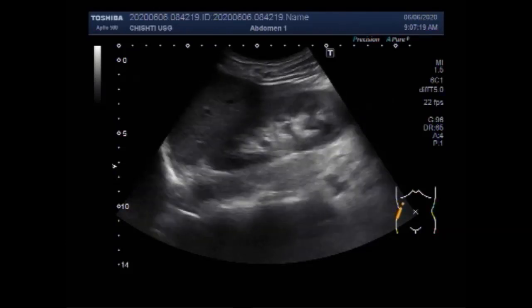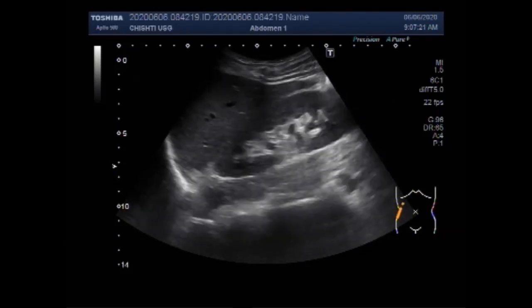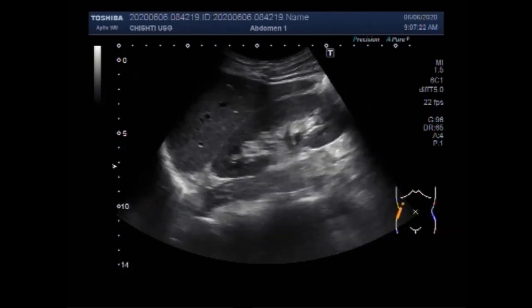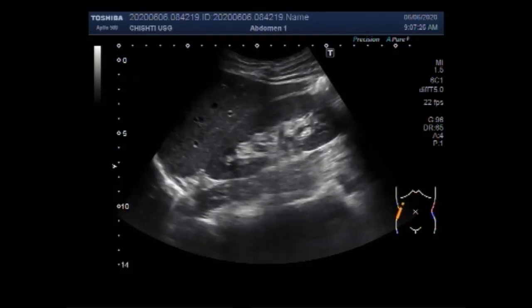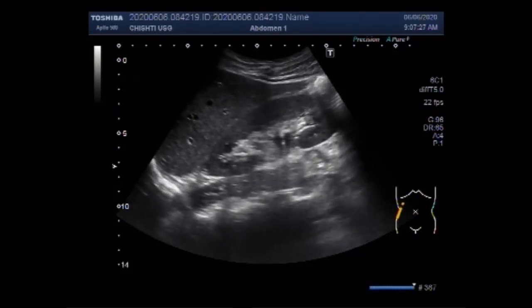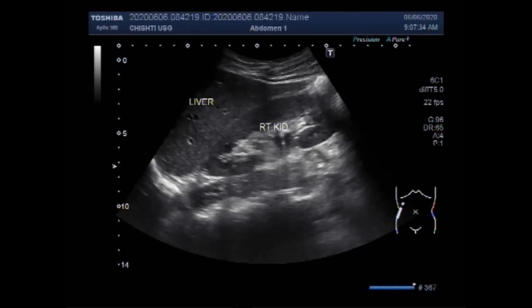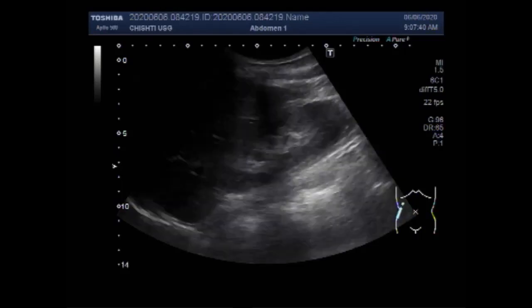You can see the right kidney and it shows minimum to mild hydronephrosis with minimum hydroureter. As you will see in the later part of this video, the size of the stone is very small and the stone lies in the distal portion of the ureter.